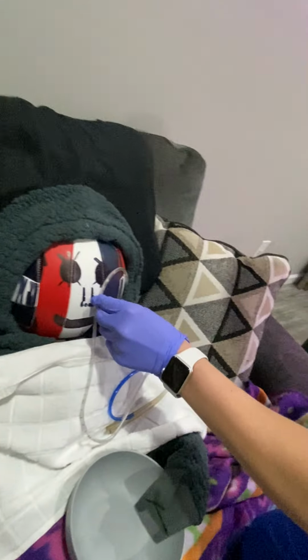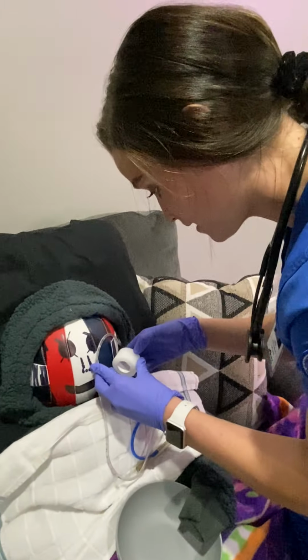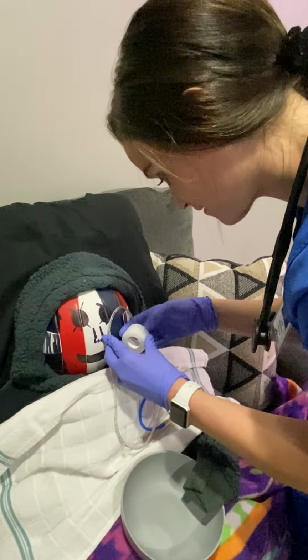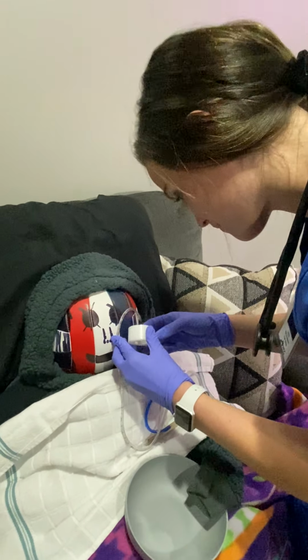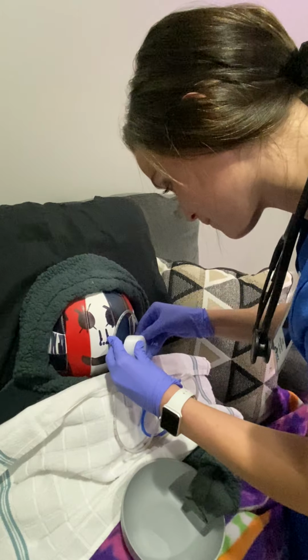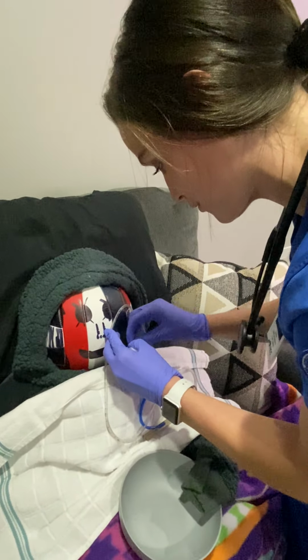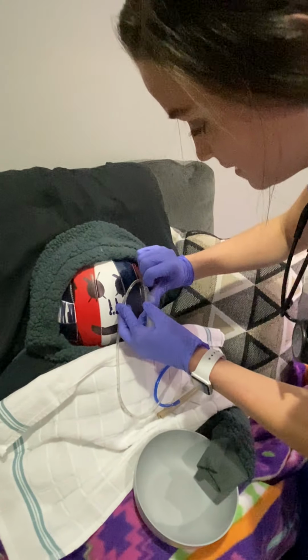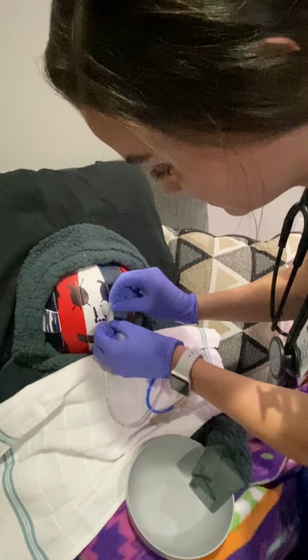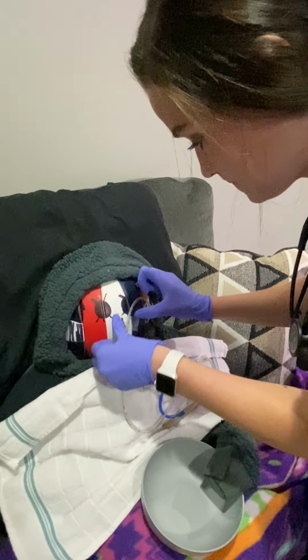Then I'm going to take my tape, which I should have already had this ready. And when I prepared this, I'll have 3 to 4 inches, and I will just secure the tube in place on my patient's nose.